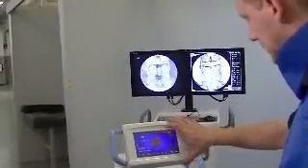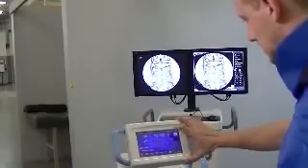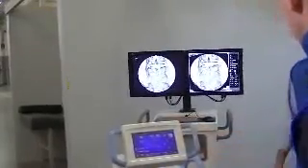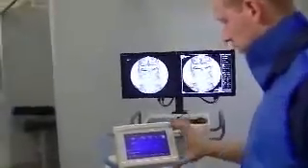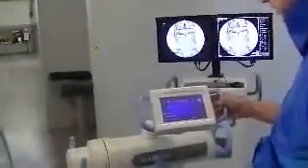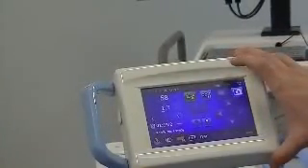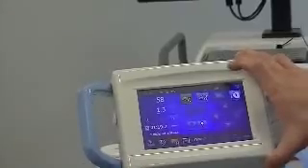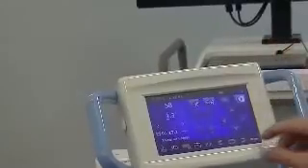Here is negate. These are all the vascular functions. You click on the A+ tab — you have your subtraction and road mapping. You can take an image, though it's not friendly to a cadaver so the subtracted image won't show up. And you can do cine runs.